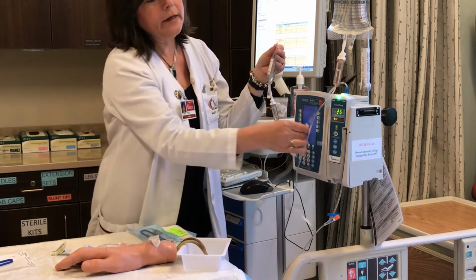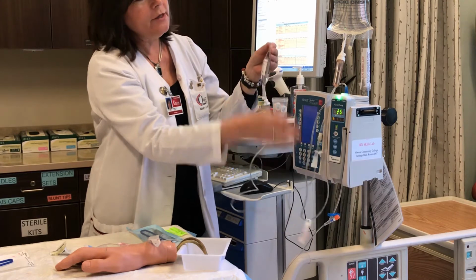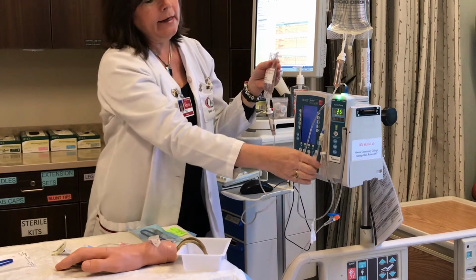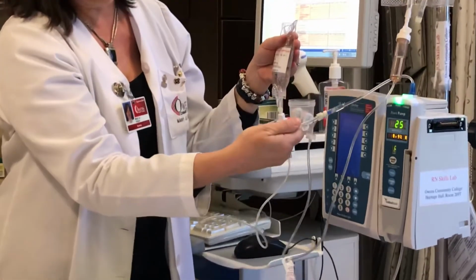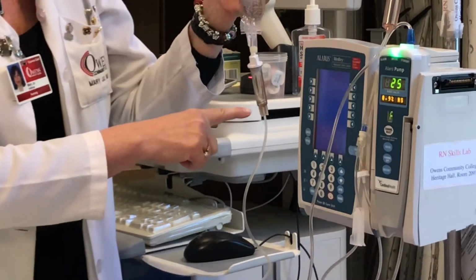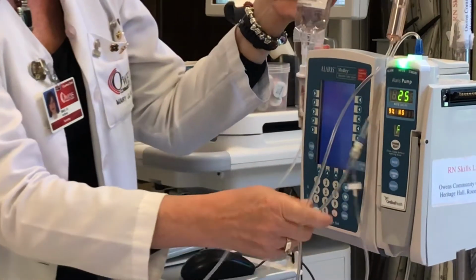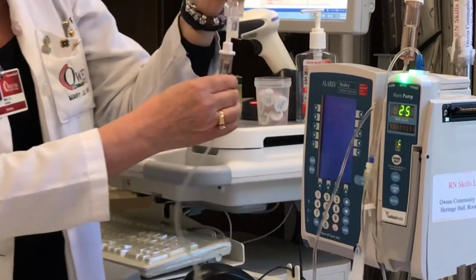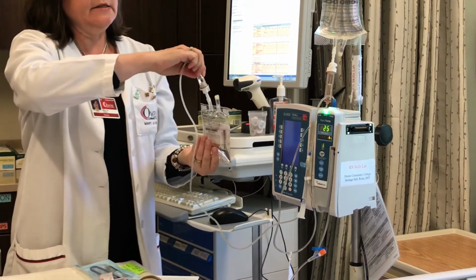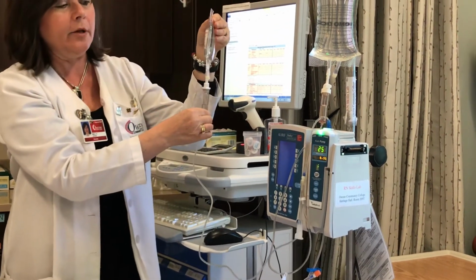I connected the tubing already, and this is a demonstration of back priming. The first thing you'll do is hold your secondary IV piggyback below your main line, and then you'll open the secondary clamp. The fluid from the main line, which is compatible with my secondary piggyback medication, will back prime in until the drip chamber is halfway full. If for some reason I overfilled the drip chamber, I can squeeze that into my secondary because I did check in the beginning and these two fluids are compatible.